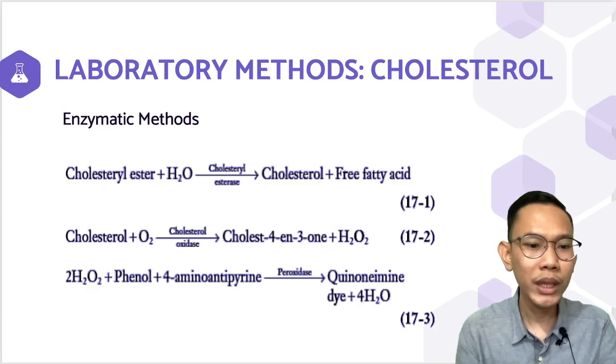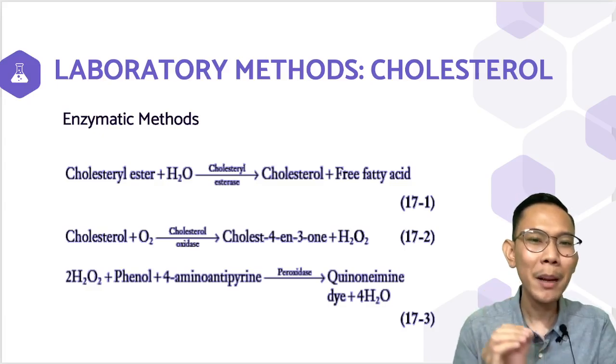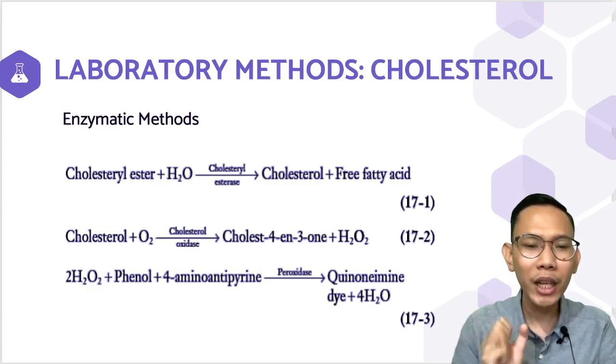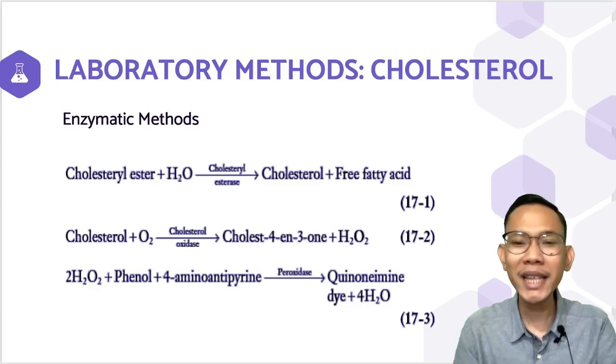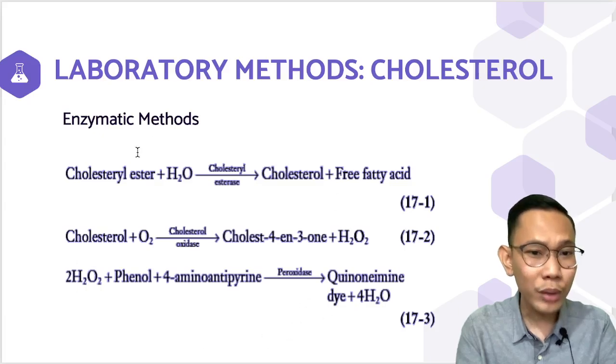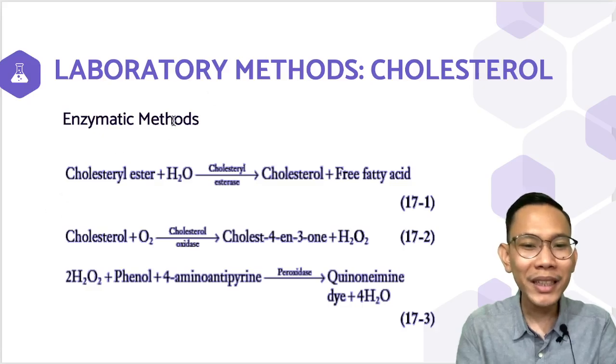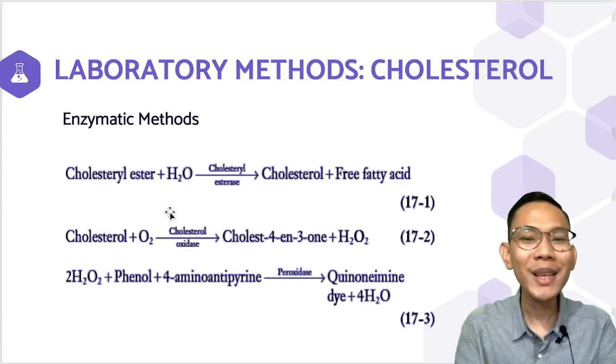Now let's proceed with the enzymatic methods. Usually these are really what is used in the package inserts. It's really your enzymatic method. So I want you to be familiarized with the reaction because later when we discuss the package insert, we will discuss this again. The discussion of the enzymatic method is really repetitive.